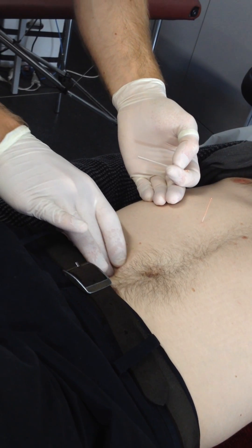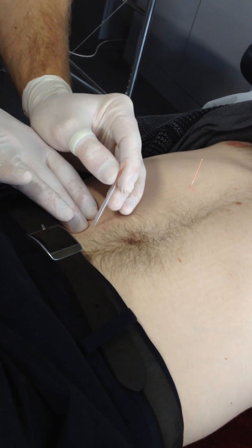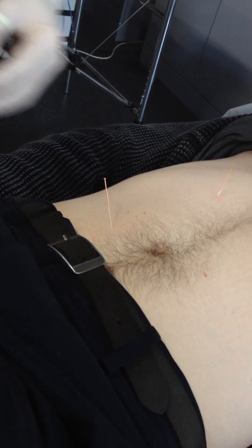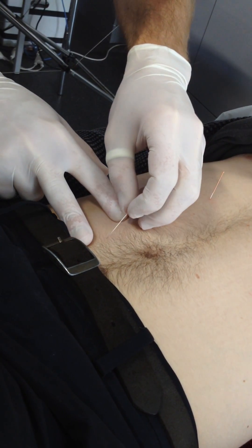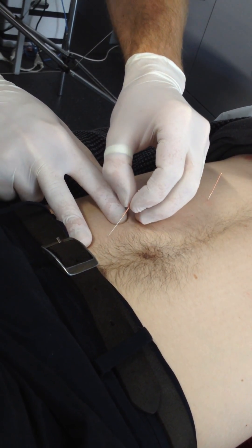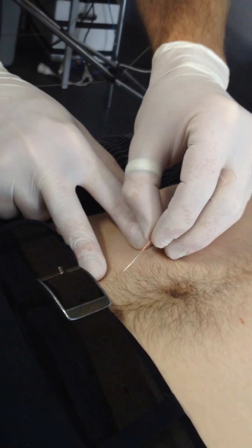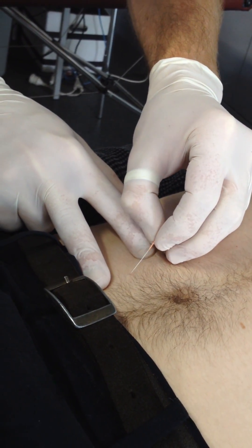So I'm using a 30 with him, and then we can come down onto here — needle on that oblique angle. Still passing through there. You all right, Sam?